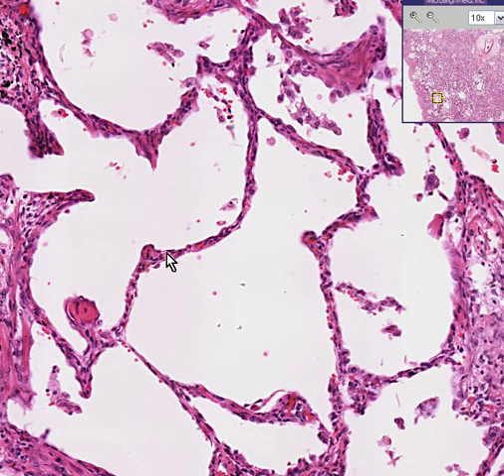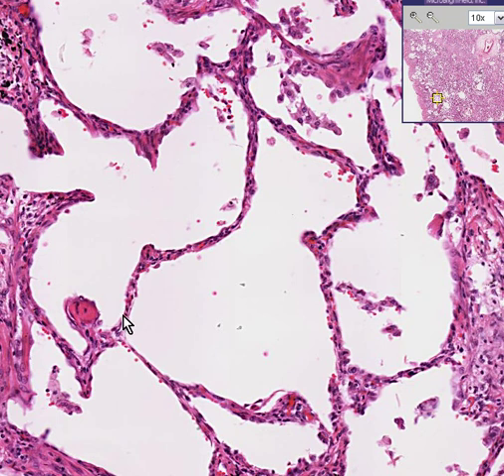Remember, alveoli are nothing more than just alveolar-lined spaces and capillaries — not much fibrous tissue at all.